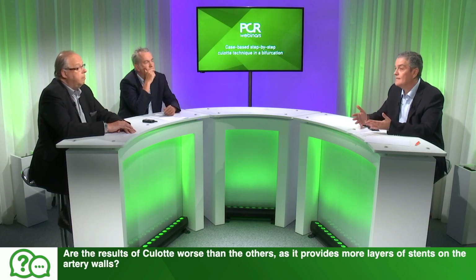Yeah. The length of overlap seems to be very important also for people who follow this webinar. The question is, are the results of culotte worse than others because it provides more layers of stent on the artery wall? But overlap and more layers depend on how much you want to overlap. It's a recent trend in all bifurcation stenting to minimize overlap, and actually results depend on whether the study is performed in Europe or in Asia.